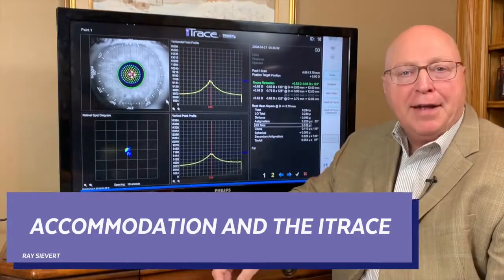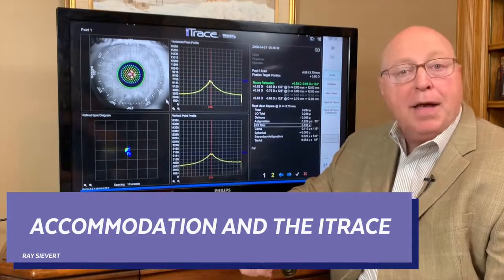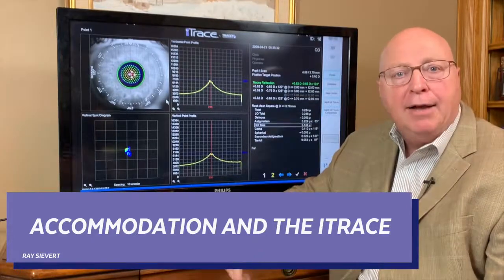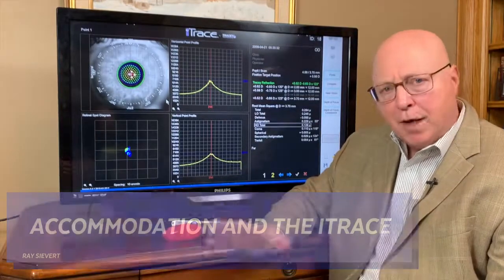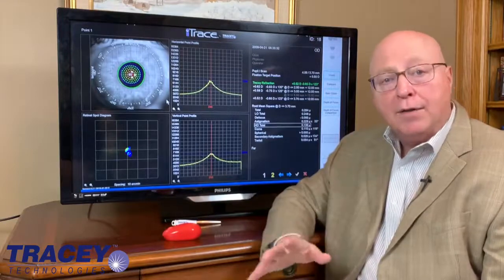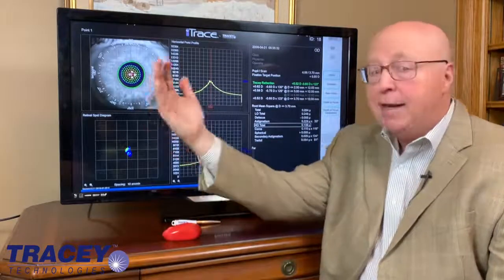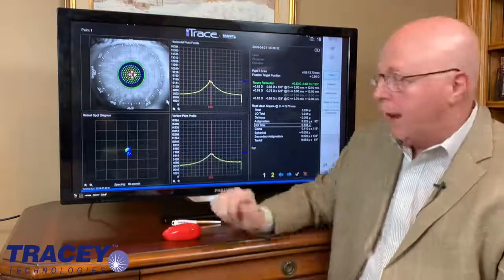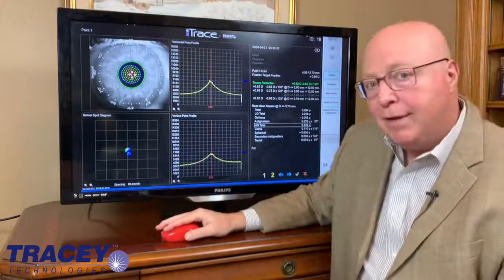Hi, Ray Sievert with Tracy Technologies. Today we're going to talk about accommodation, how you measure it with the Eye Trace, and what it shows you. We're going to start with a younger patient and look at their distance refraction. The Eye Trace is the only device in the world that allows you to look through it at an infinity target, take an auto refraction, and then have a reading card held up in front of the patient and take a second refraction. So in this case we have a distance exam and a near exam and we're going to compare the two.